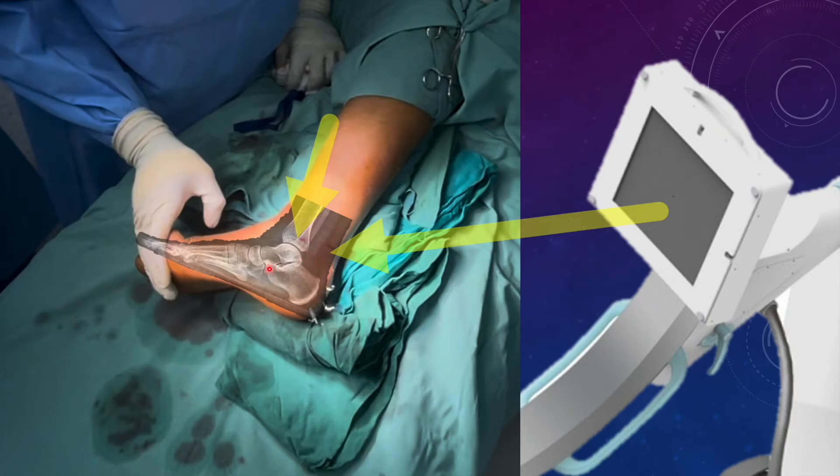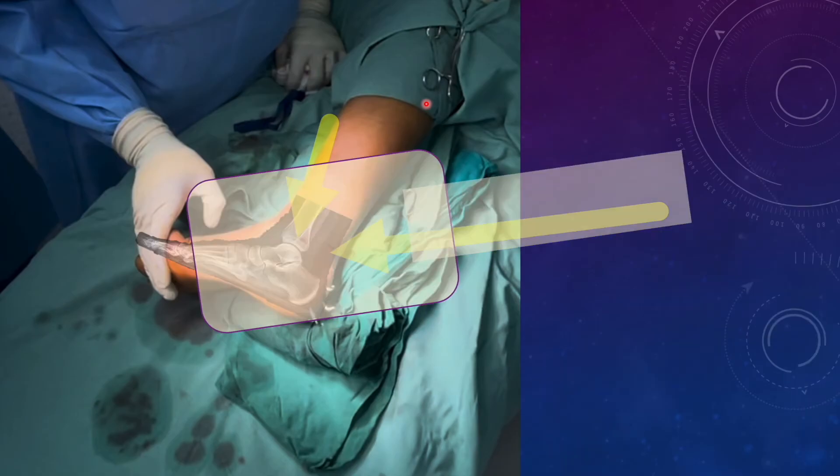By aligning the C-arm obliquely to the table, you are actually making the beam parallel to the posterior facet. See how easy it will be to dorsiflex the ankle — you can simply dorsiflex the ankle without blocking the beam passing through the posterior facet. No assistant will be required to lift the leg in an abnormal internally rotated position that would hinder the axial view.